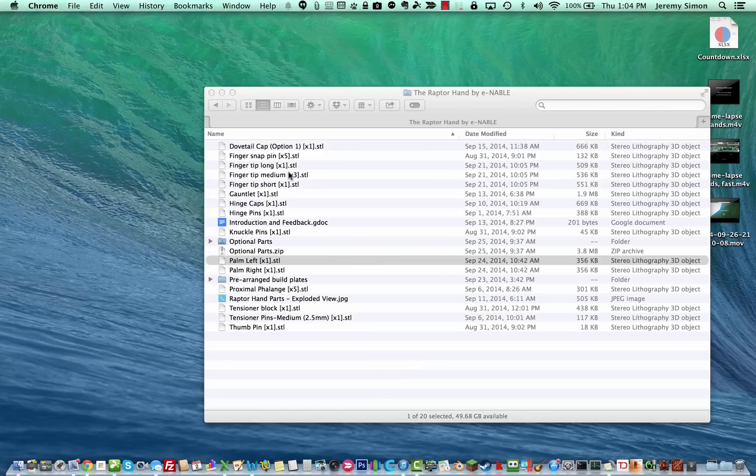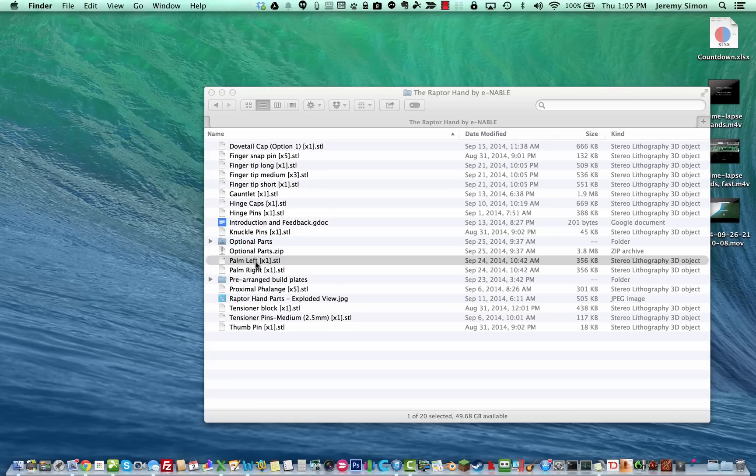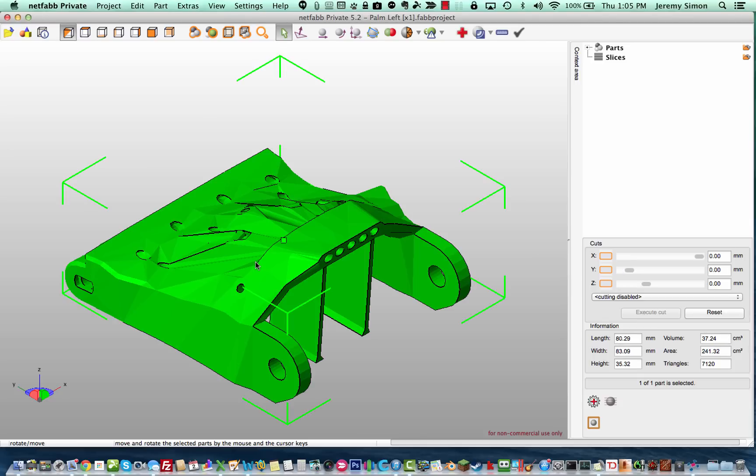And then you can open up a file of your choice in NetFab after installing it. I'm going to use the Raptor design from Enable here. This is one of the 3D printed prosthetic designs that we use, and that often requires a lot of scaling, so it's a good case to show for this. I'm going to open the palm file here for the Raptor, and this is what it looks like inside of NetFab.